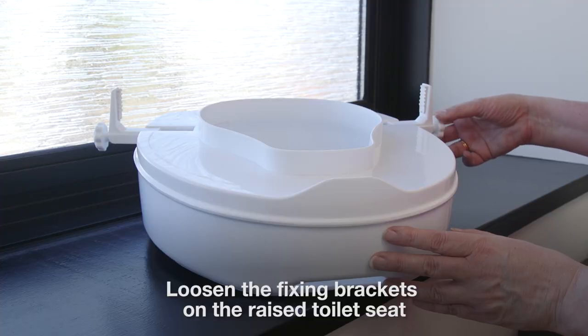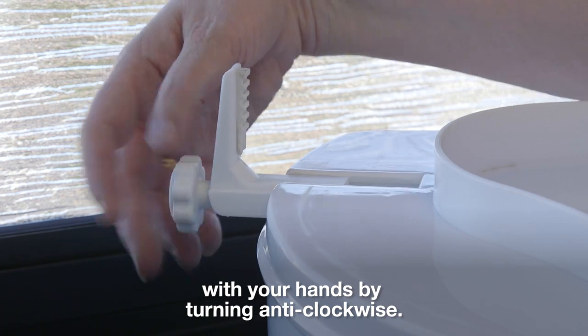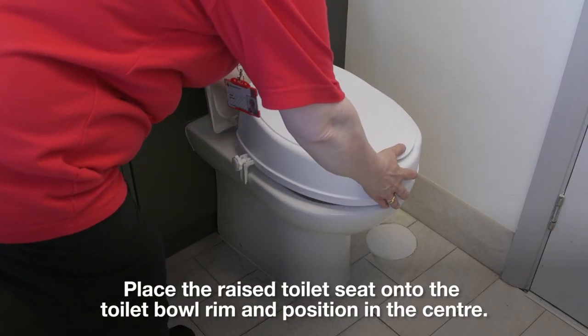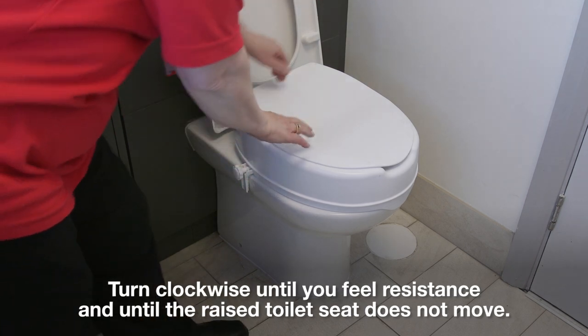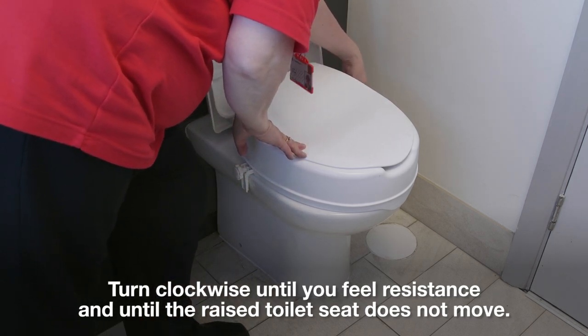Loosen the fixing brackets on the raised toilet seat with your hands by turning anti-clockwise. Place the raised toilet seat onto the toilet bowl rim and position in the centre. Tighten the fixing brackets on the seat by hand, turning clockwise until you feel resistance and until the raised toilet seat does not move.